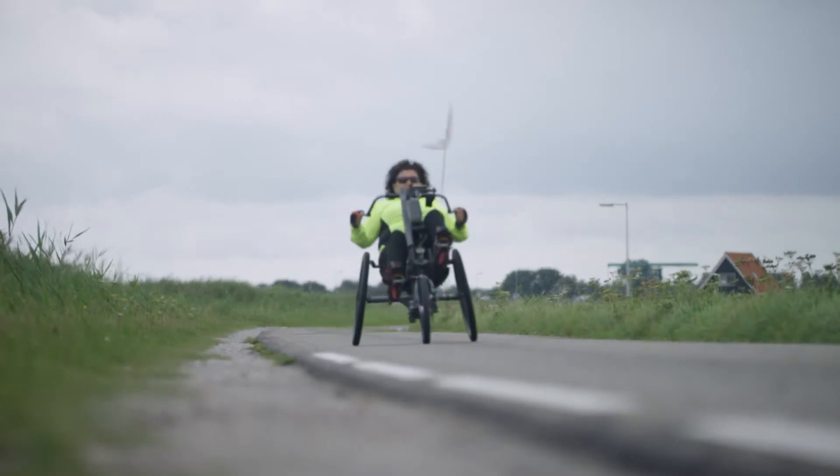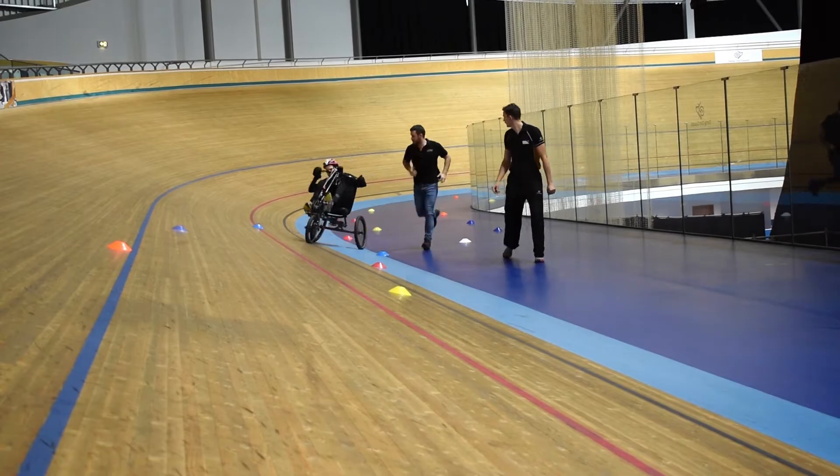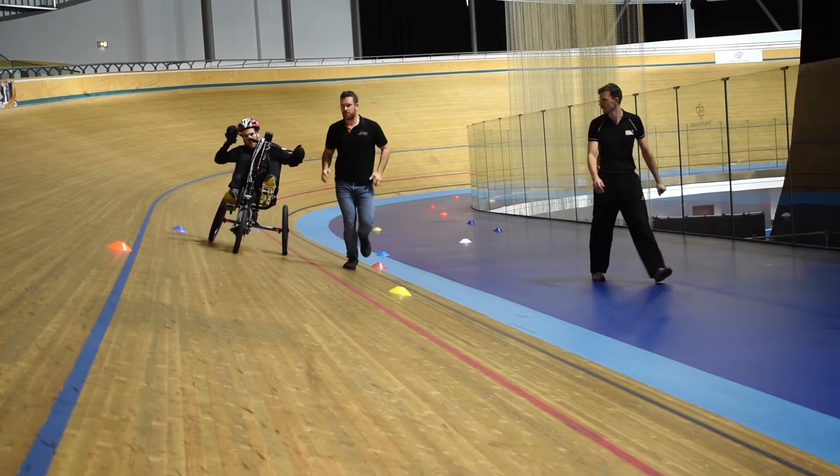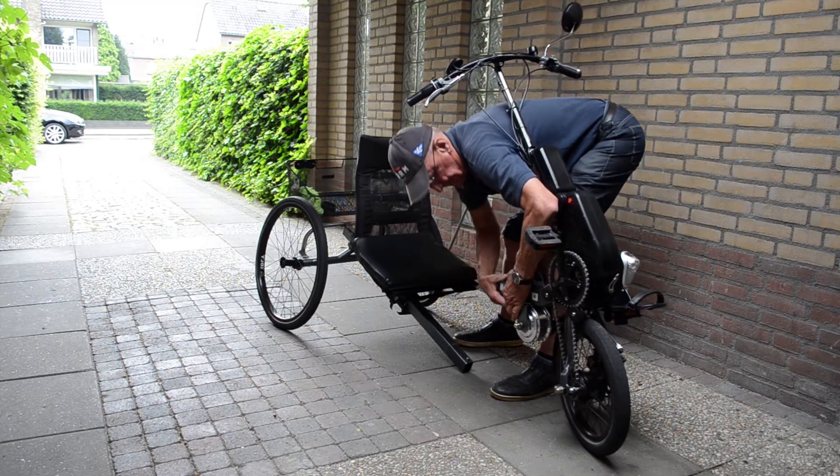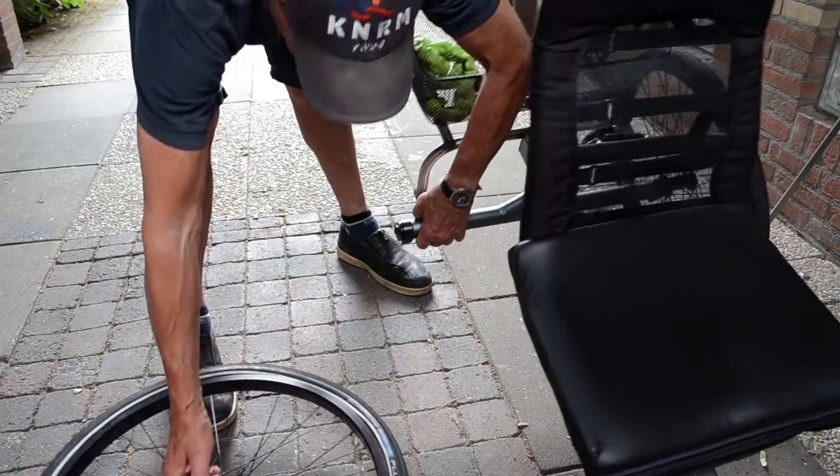Of course, the tricycle can also be equipped with electrical pedal assistance. The Birkle Bike Pro is made of lightweight aluminium and, thanks to its quick release locks, it's easy to take apart and to reassemble.